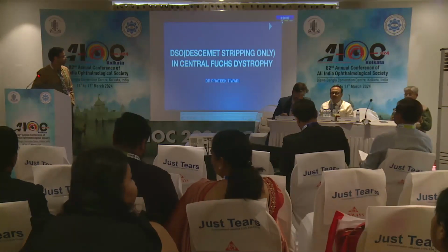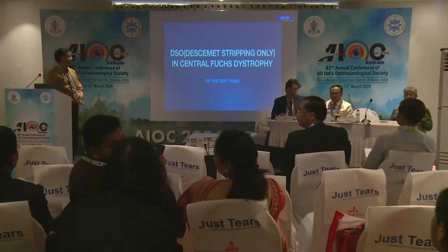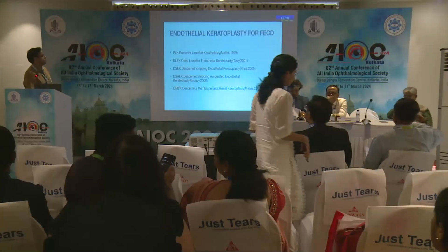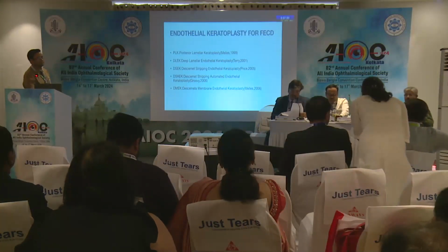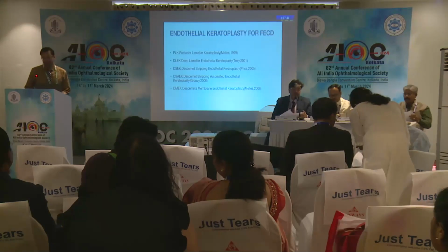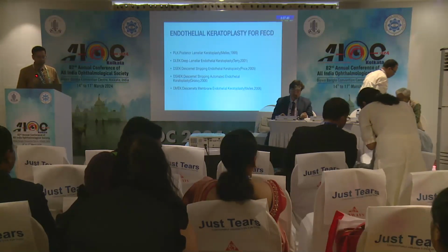Hello everyone, today I'll be presenting DSO, that is Descemet stripping only, in a case of central Fuchs dystrophy. So coming to the evolution of endothelial keratoplasty for Fuchs endothelial corneal dystrophy. As we all know, in the early 90s, the only option for a corneal surgeon to manage a Fuchs dystrophy was to go for full thickness penetrating keratoplasty.